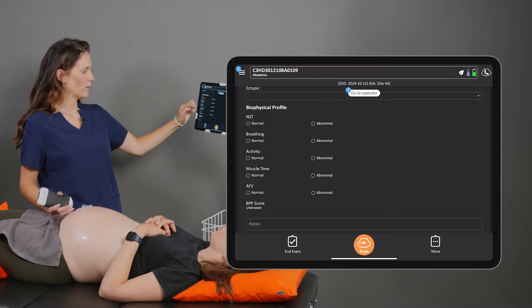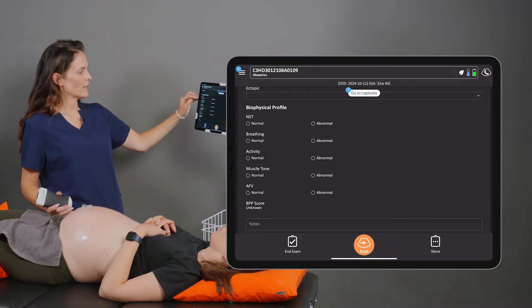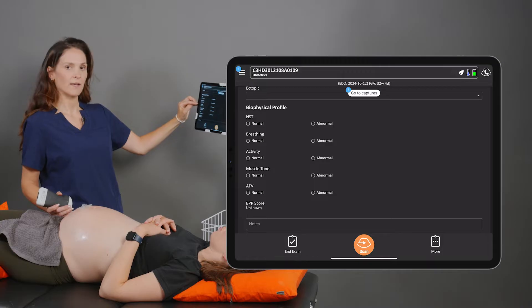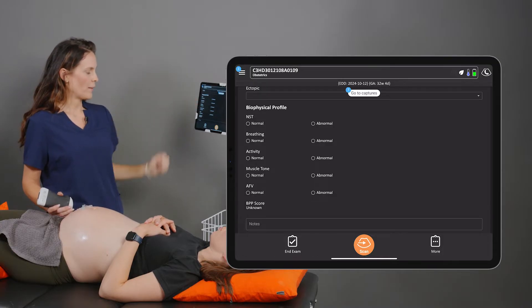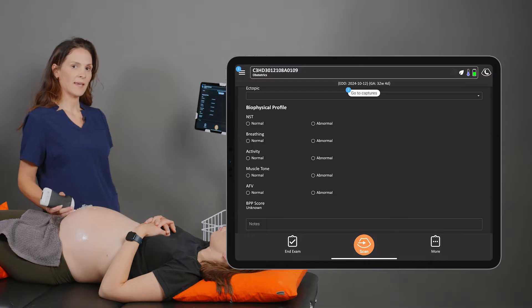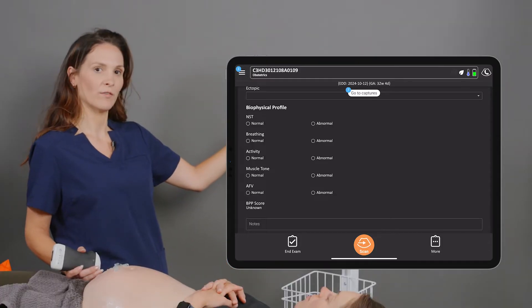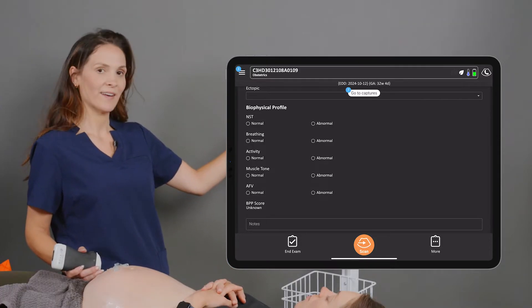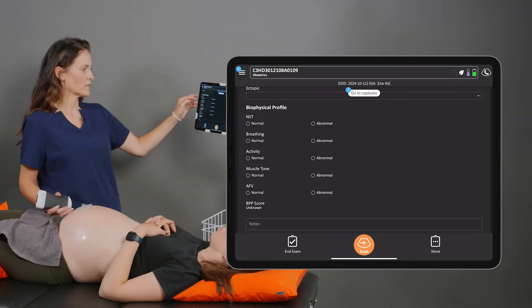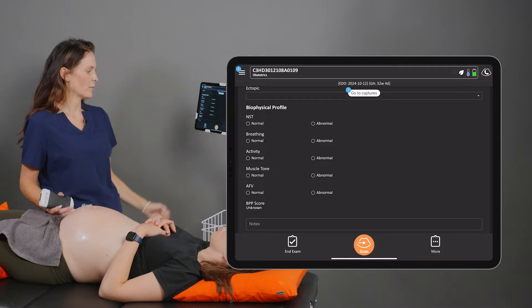There are four components for the ultrasound assessment: fetal breathing, fetal activity, muscle tone, and amniotic fluid volume. This is a 30-minute scan, and the baby has 30 minutes to demonstrate all four of those portions to get a normal score. Each portion gets a score of two for normal or zero for abnormal.